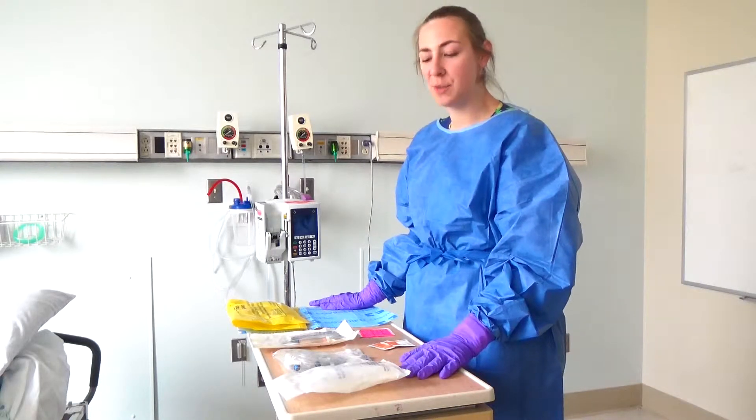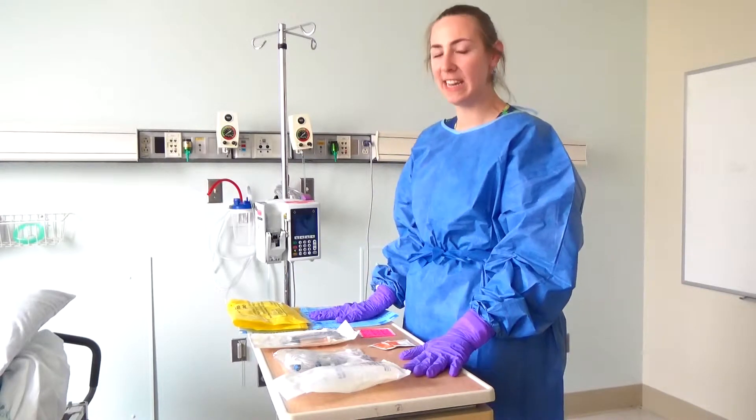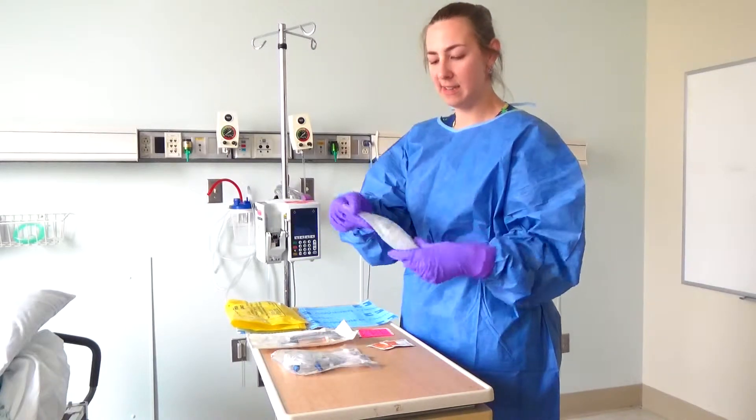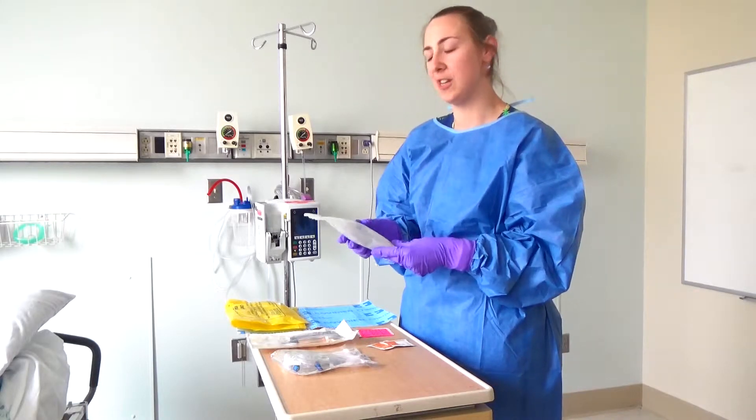Now I'm going to show you how to prime your primary and secondary line to begin chemo administration. The first thing you'll need is a bag to prime. Most of the time we use normal saline, but for specific drugs you might need to use dextrose solution.